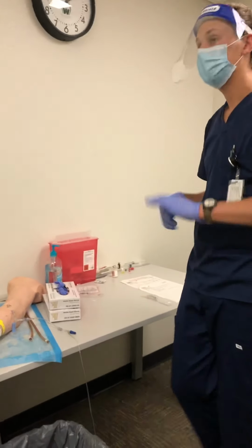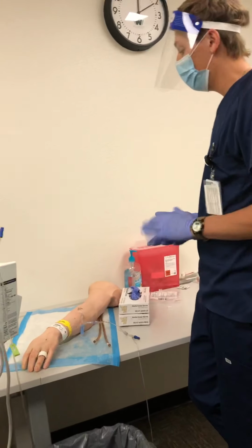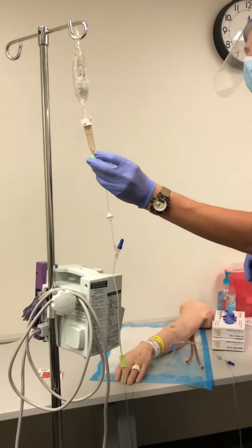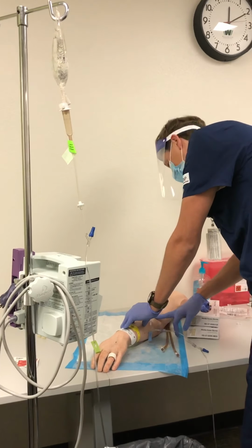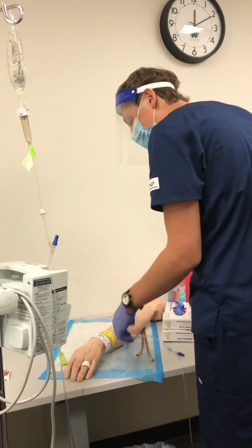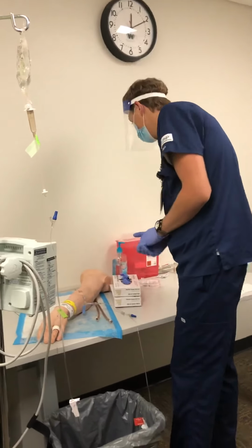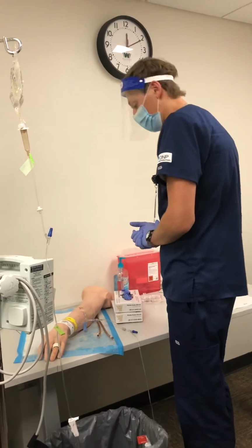So time's passed now, the infusion's finished, so I can then go back into the room, knock, provide privacy, wash my hands, glove back up, and then I can make sure that we're ready to disconnect the IV. I'm going to look at the site, make sure there's no sites of infiltrations or anything. Make sure that I have the right patient, so same thing, name and date of birth, ask the patient, they can confirm, I can confirm with my MAR, their wristband, and then their allergies as well. So I can then explain what we're going to be doing. We're just going to be disconnecting this and getting you ready.